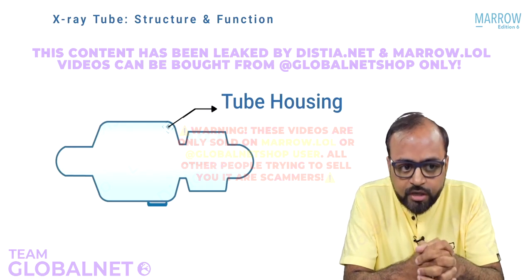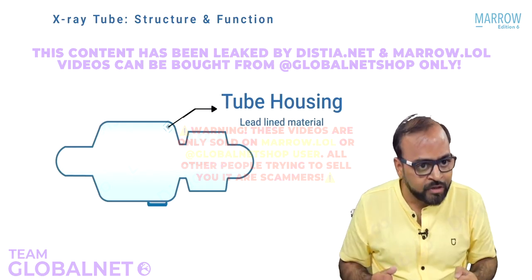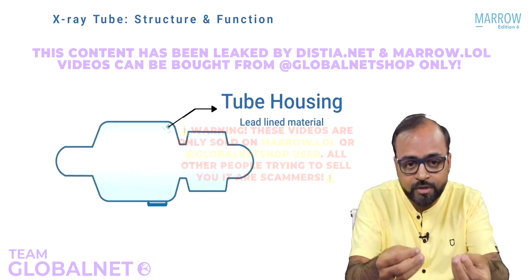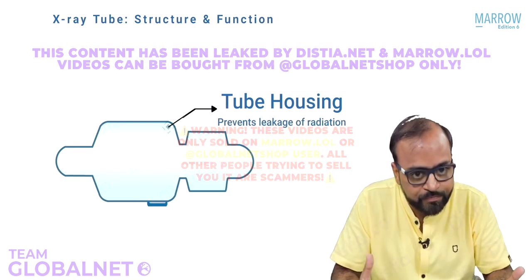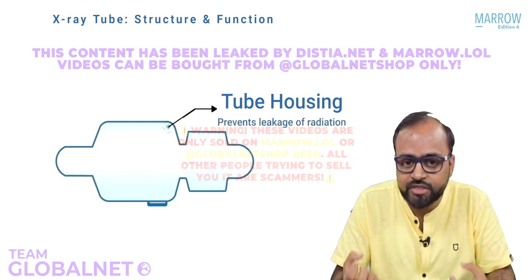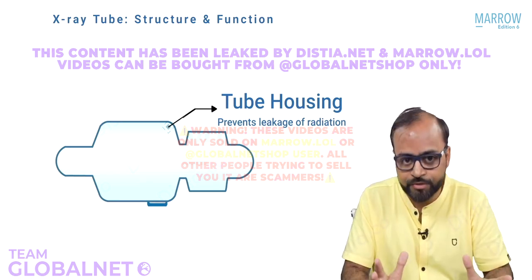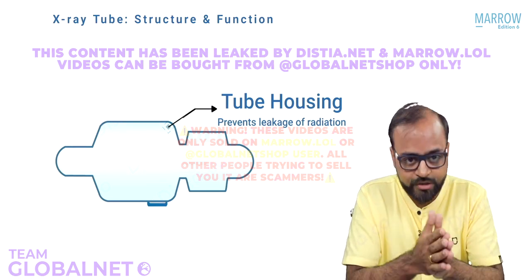What is the tube housing? The tube housing is basically a lead lined material, right? Why lead lined? Because X-rays are going to be produced inside the tube. So this lead lined material prevents the leakage of radiation, and therefore it protects the patients and the department staff from this leakage radiation. And that is the function of this particular tube housing.